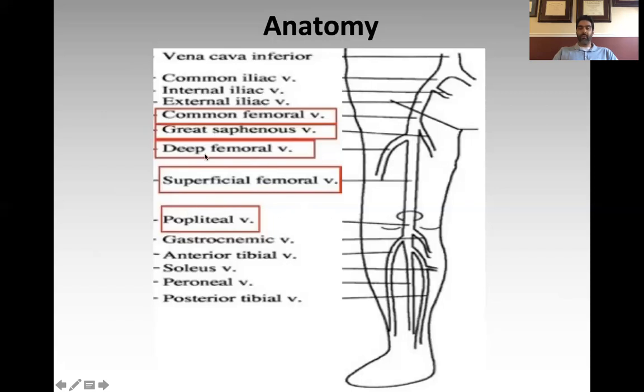Okay. These are the required views. You can sometimes identify the trifurcation of the popliteal vein in the popliteal fossa. Sometimes that trifurcation, the branching into 3 branches, occurs further down in the leg. But if you can see it up here, identify that and compress it.